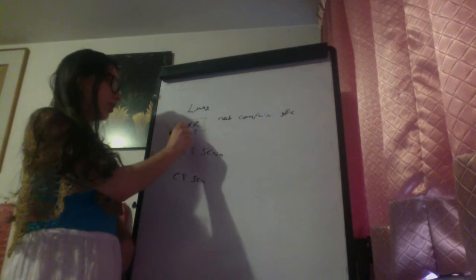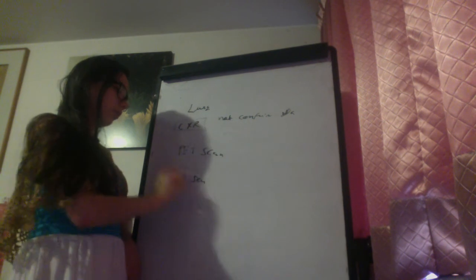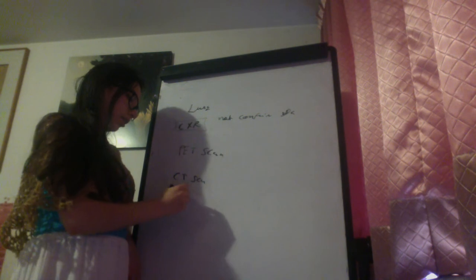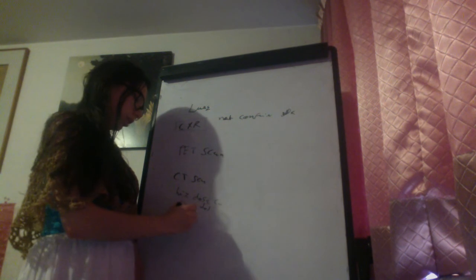So in this, the chest X-ray can be visualized a little more blurred than this, so we would be ordering more testing. The CT scan could be with high dose contrast, low dose, or no contrast.